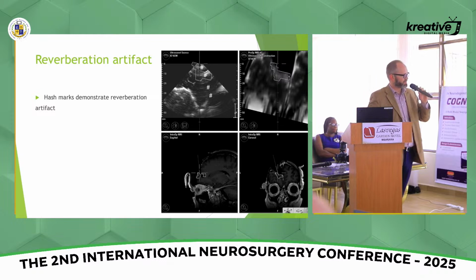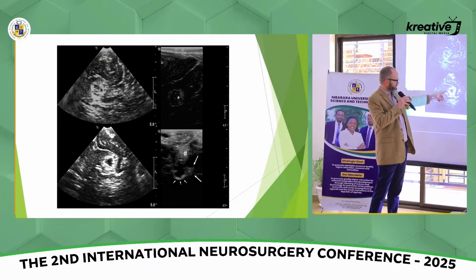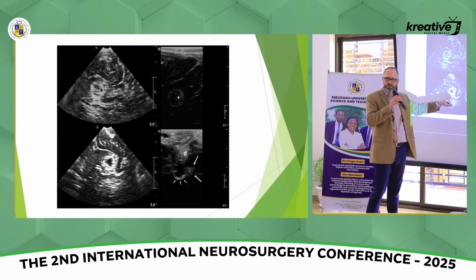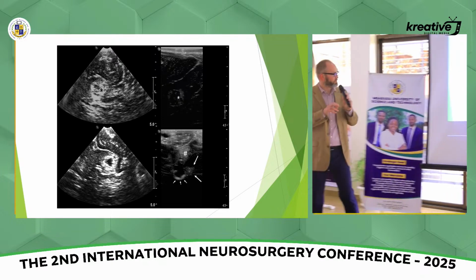This is an abscess. Just to show you an example, you see the wall of the abscess and the center of purulence or necrosis. So that shows up quite well.